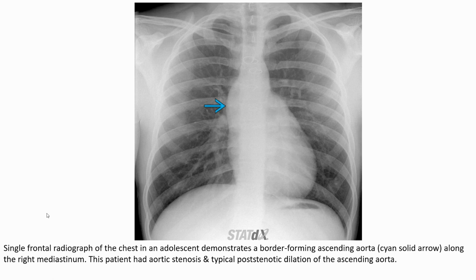In this adolescent, the image demonstrates a border-forming ascending aorta along the right mediastinum. This patient had aortic stenosis, with typical post-stenotic dilatation of the ascending aorta.